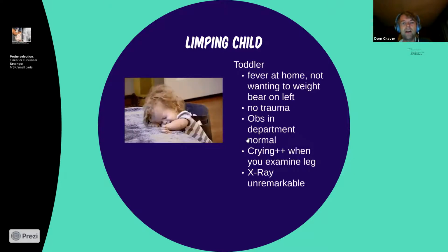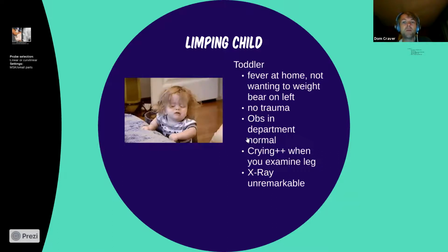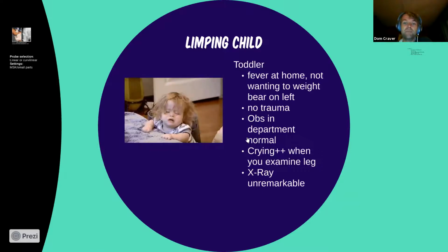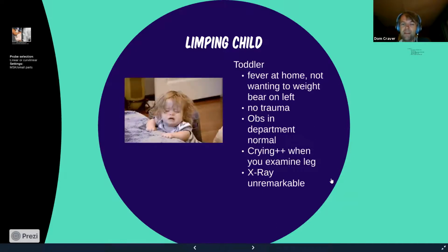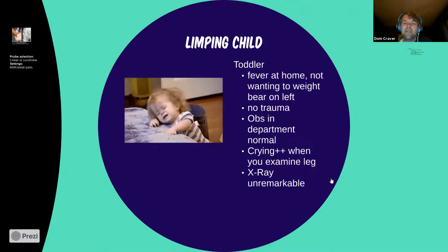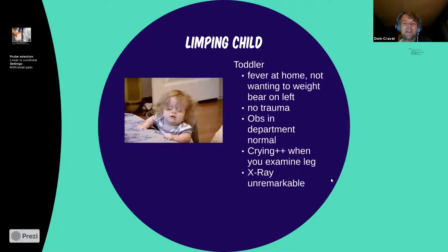Okay, so here we're going to talk about doing hip ultrasound. So I'm not talking about doing ultrasound looking for fractures. I don't do that much, but I know lots of people do it. And I do it just out of interest, but it's just not in our SOPs yet, but that's another thing to cover at some point.